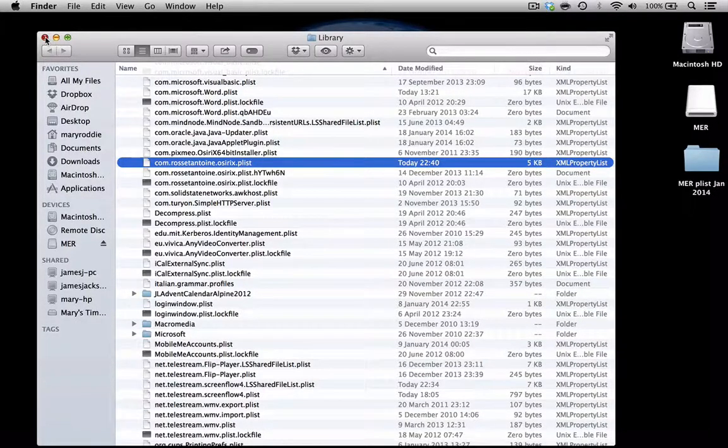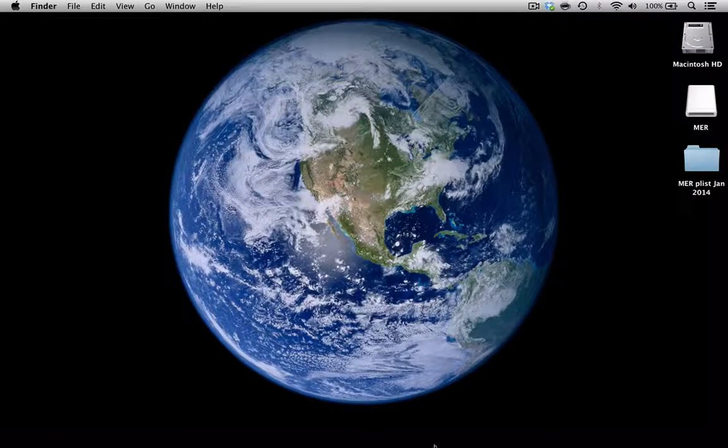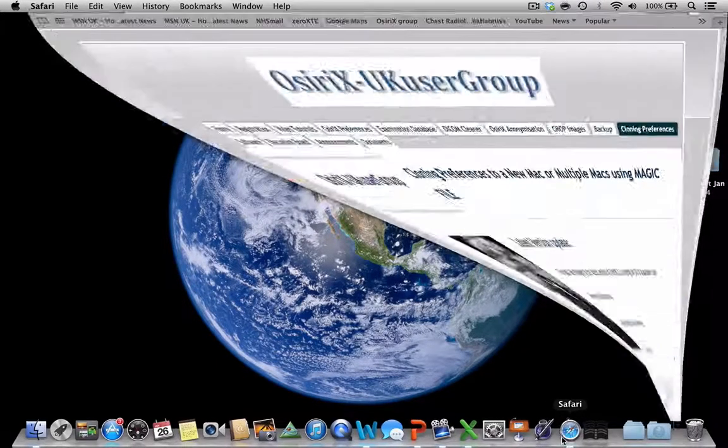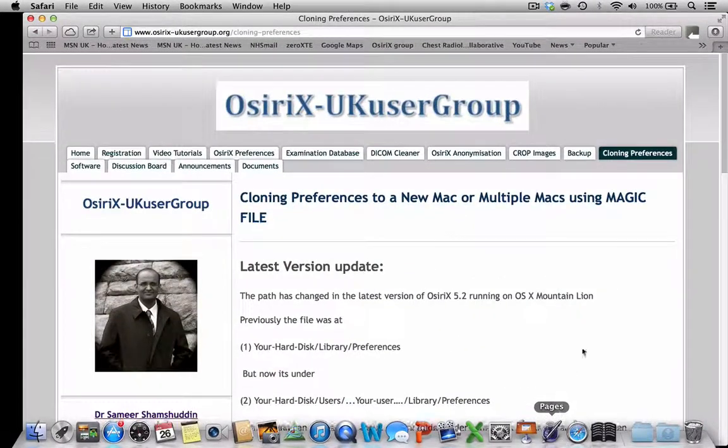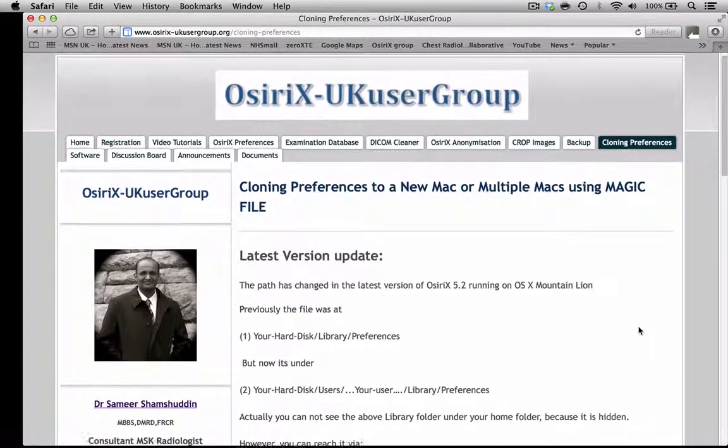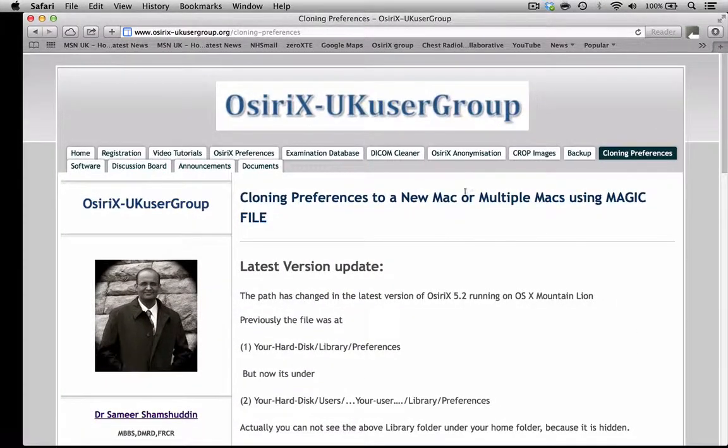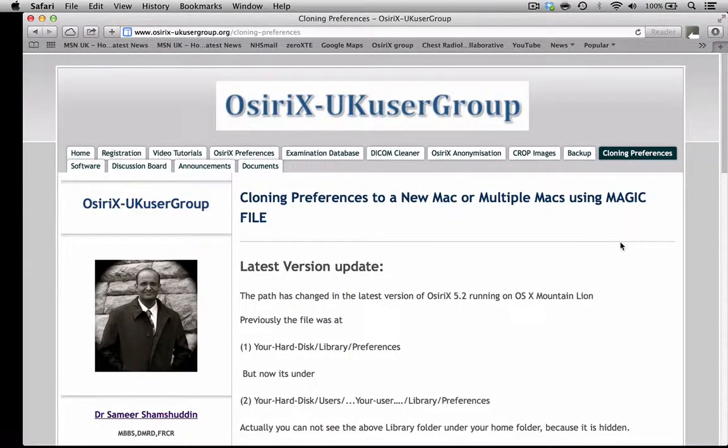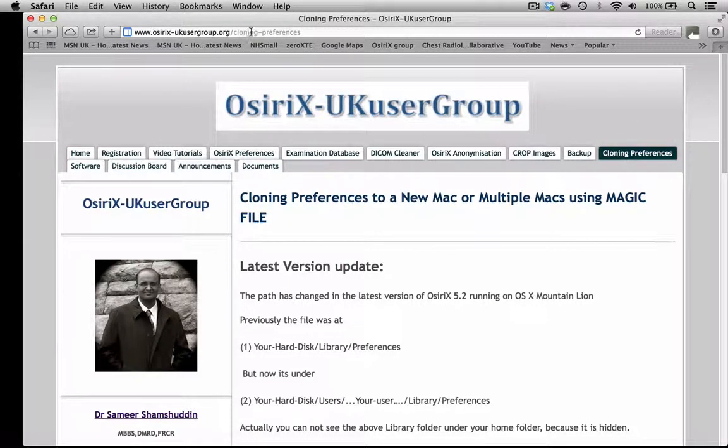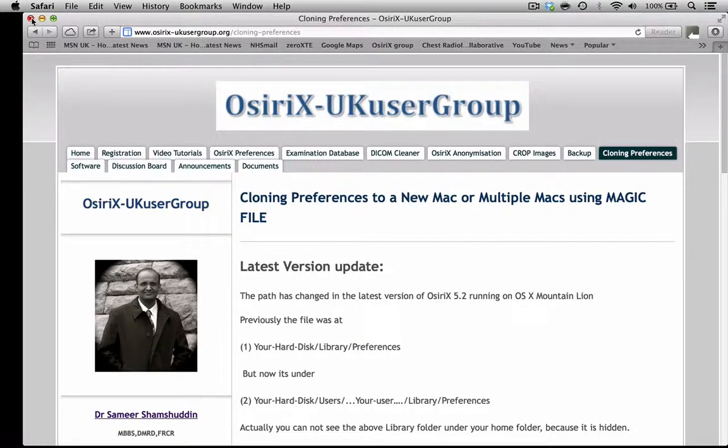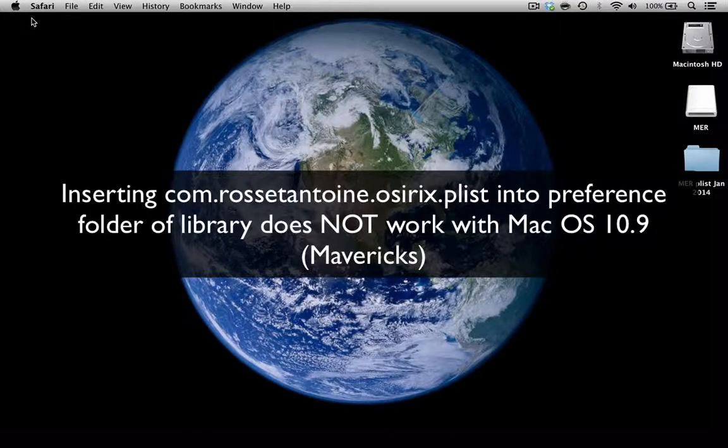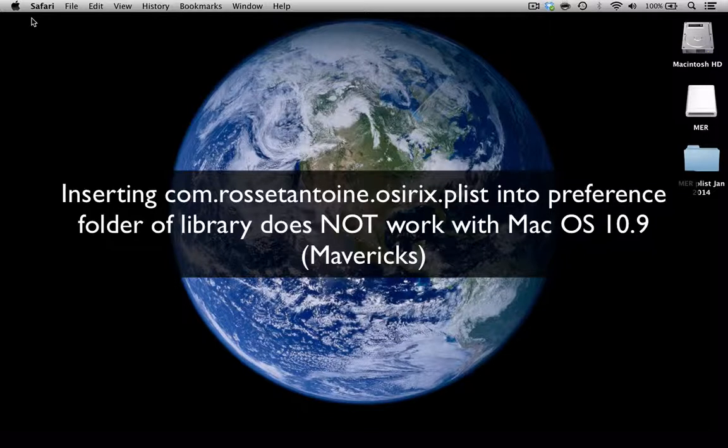This has actually been very well described in a tutorial on the OSirX user group website which I'm showing you here under Cloning Preferences, but the reason for me making this new video is that this technique actually doesn't work with the latest version of the Macintosh operating system.